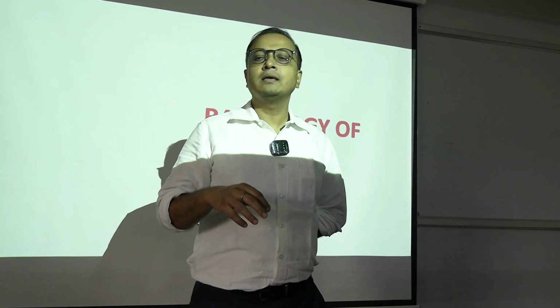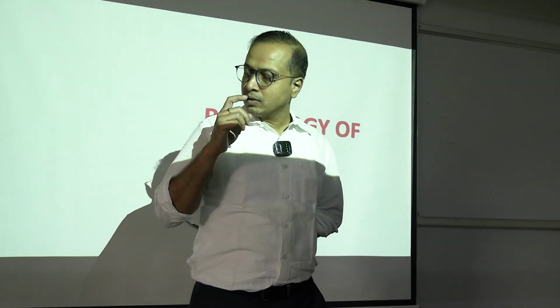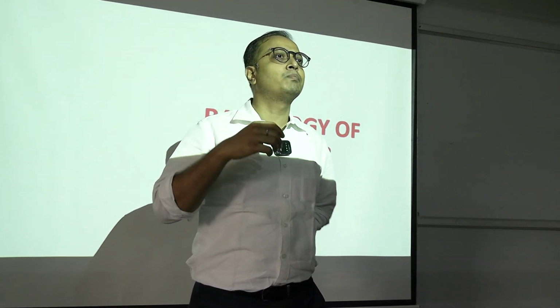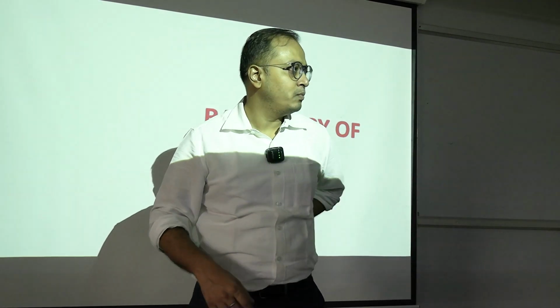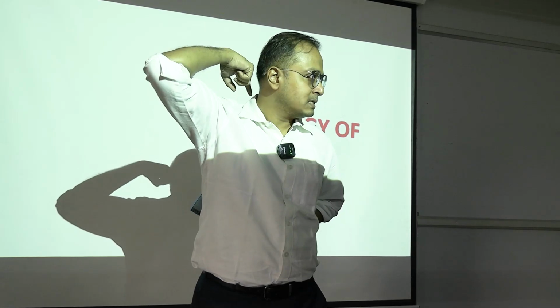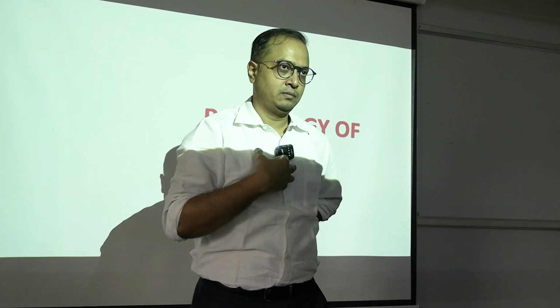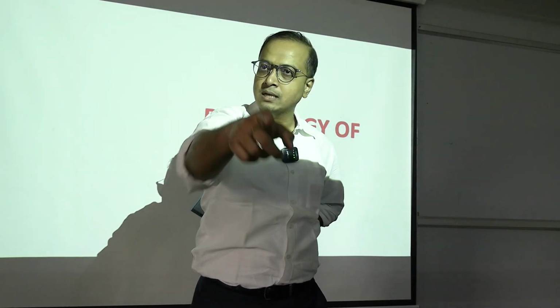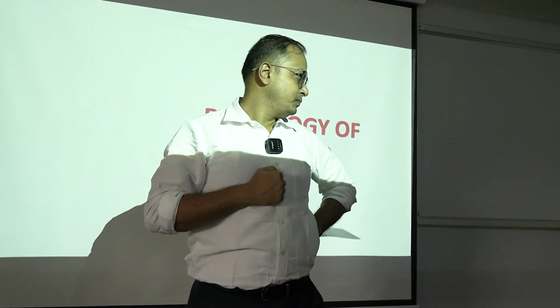So this gives us the direction of the particle, how it is coming. This particular machine is in front of me and this plate is at the back side of me. So the direction is coming from the front side of me and going to the back side. We call the view you are looking at anterior posterior, because the particle is coming from the anterior side and we are catching the silhouette at the back side. So we call it AP view.